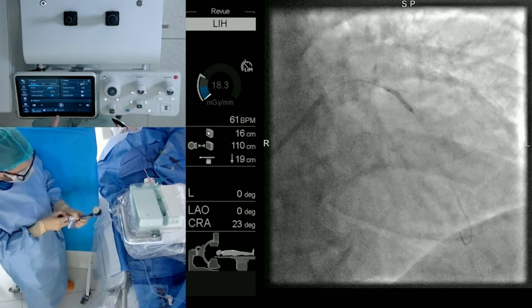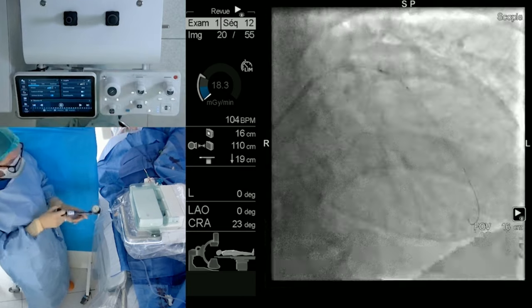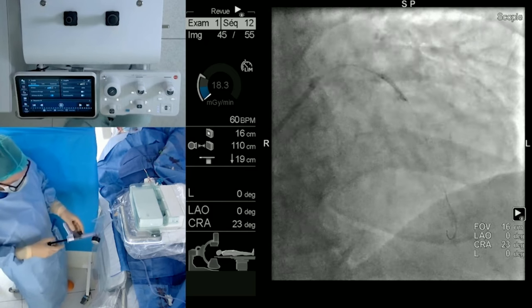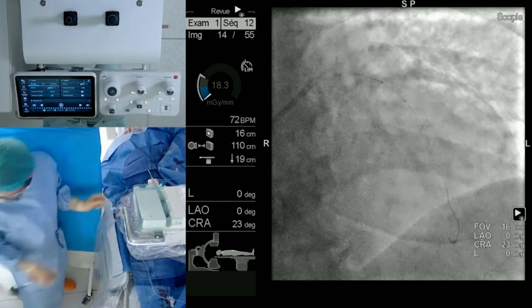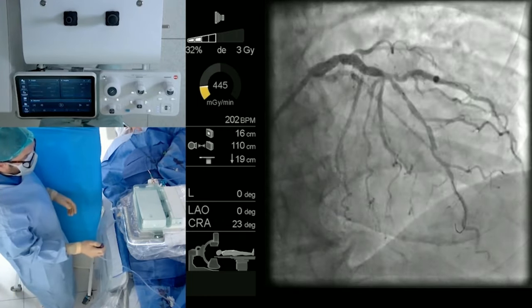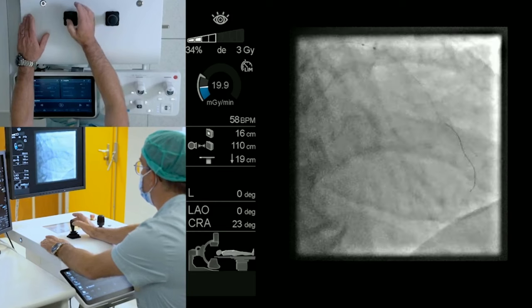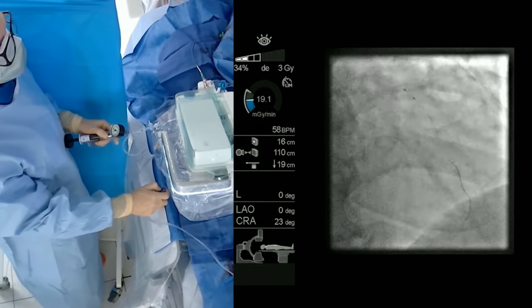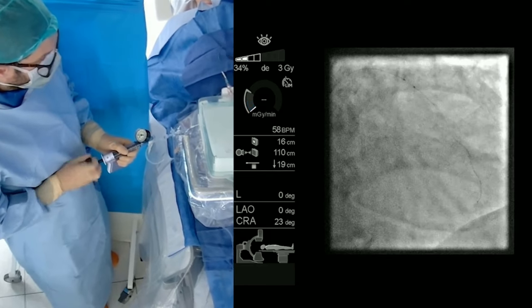So we always work on the fluoroscopy at 3.75 images per second. And you can see here the blue marker. And the graphy, when it will be in yellow color, is performed at 15 images per second. So we move the balloon in order to have... So we say that there is still a stenosis, and we decided to use a non-compliant balloon, 8 of length and 2.5 of diameter. So after checking by angiography, we will inflate the balloon.